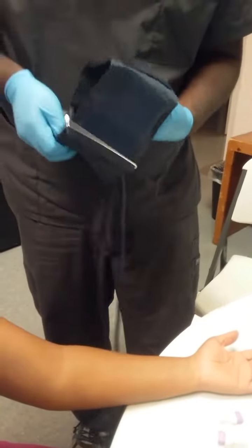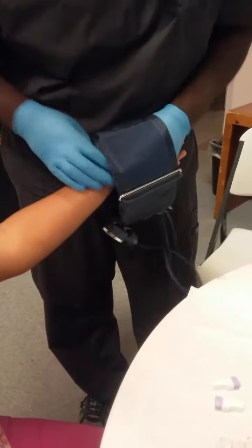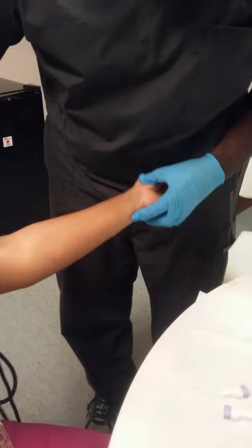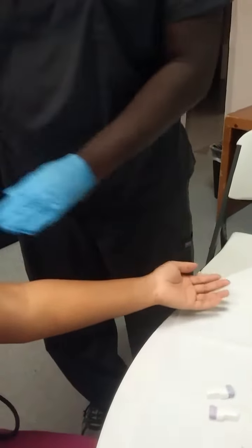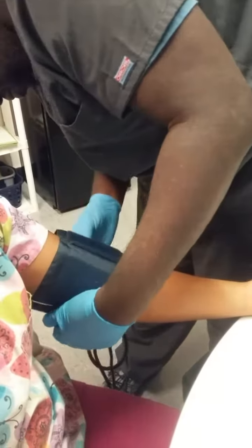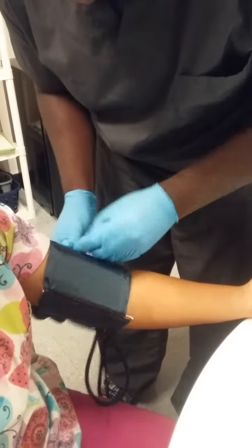So now that the region is disinfected, we apply our blood pressure cuff. We open it like so, readjust it. Take your arm, we slide it in. We put it on the anterior portion of the arm, or the palmar side, another name for it. Where's the flap? There's the flap. We close it down.